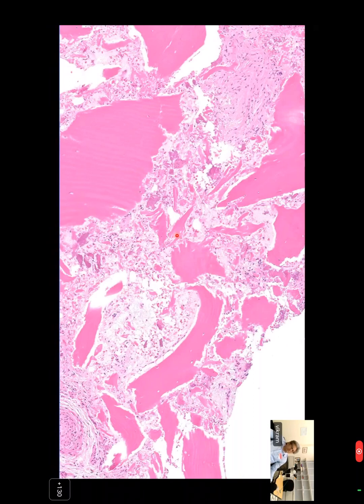Basically, in this image, I was able to see the normal, mature lamellated bone fragments. Very good. So this is lamellar bone because you can see these parallel lamellae. You can see osteocytes here. Why aren't there any nuclei here? What's going on?